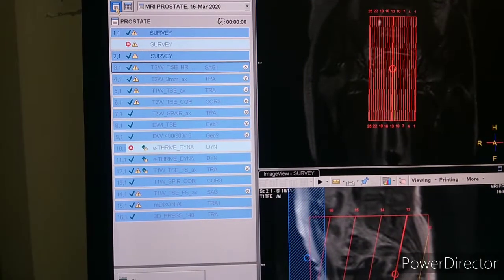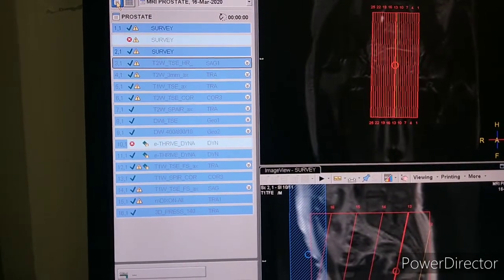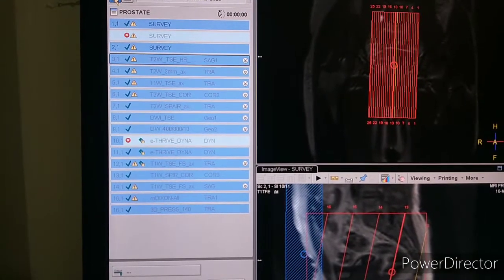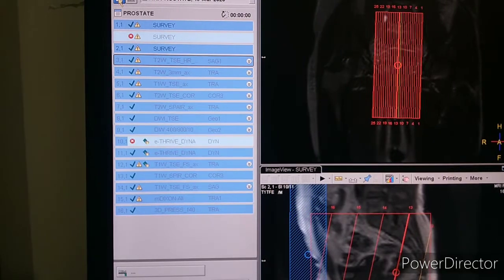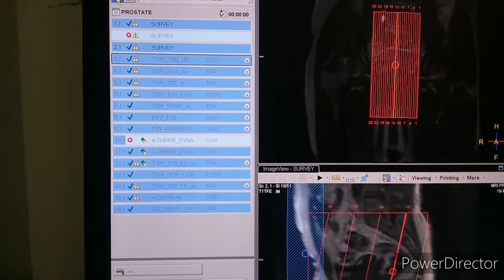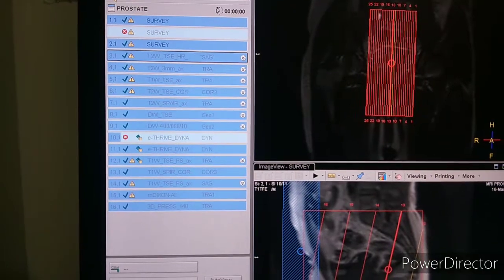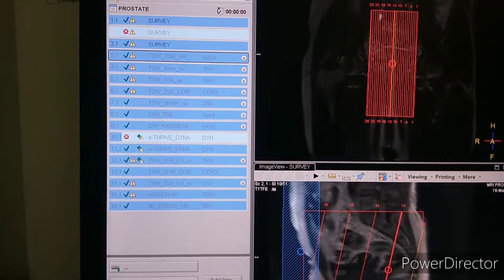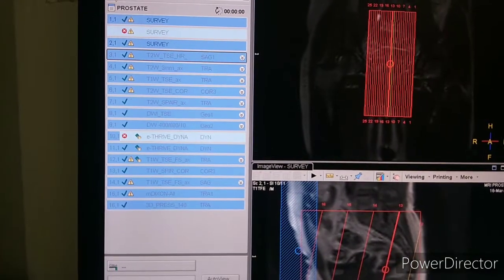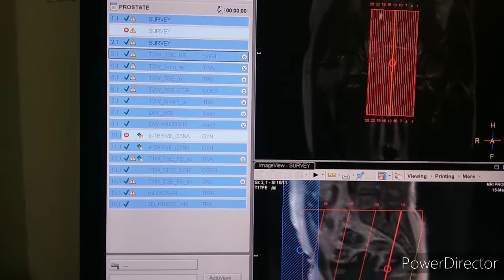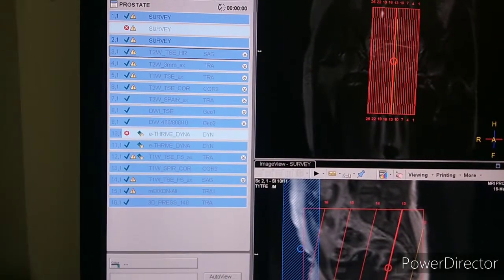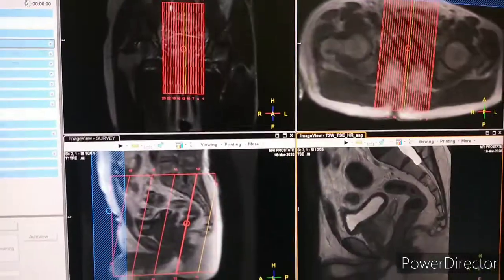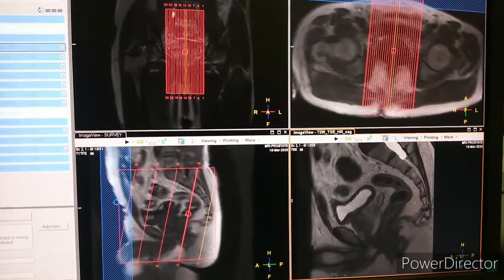This is the protocol we have acquired: 3-plane localizer, then T2 weighted sagittal, T2 weighted axial, T1 weighted axial, T2 weighted coronal, T2 axial, Diffusion and Diffusion TSE, and then post-contrast — we start with a dynamic scan, we have seven dynamics here — and then post-contrast in three planes: axial, coronal, and sagittal. The last sequence is spectroscopy.